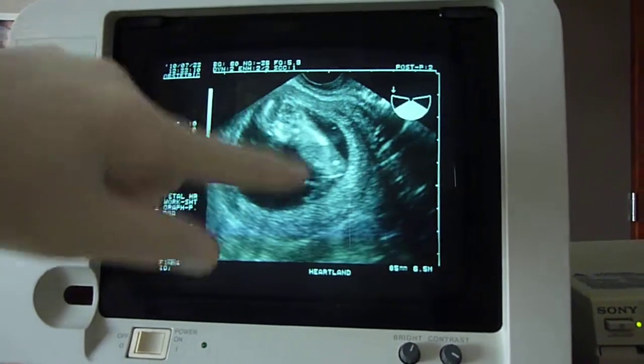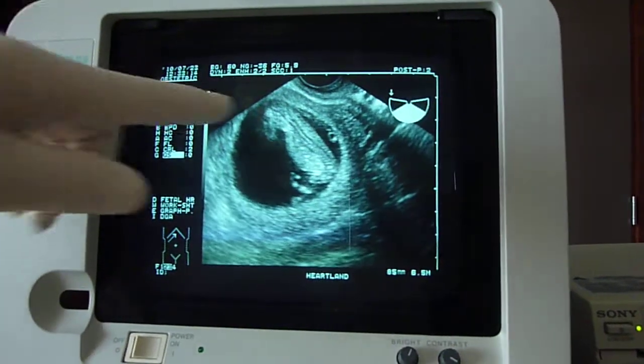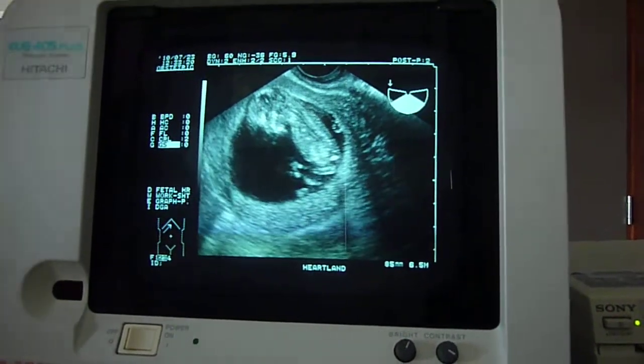You can see the hand moving there — that's the hand here, the back's over there. There's the spine — you can sort of see the spine. So the baby's nice and active, and that's good.